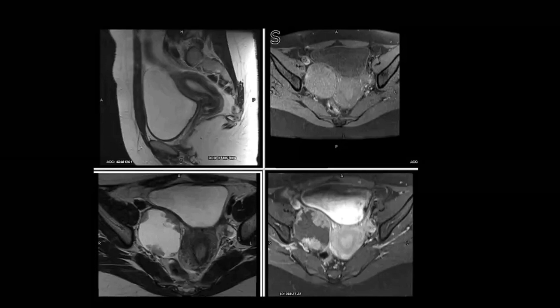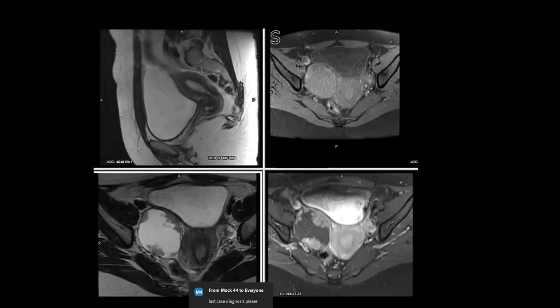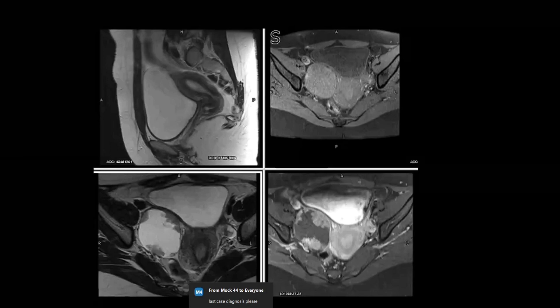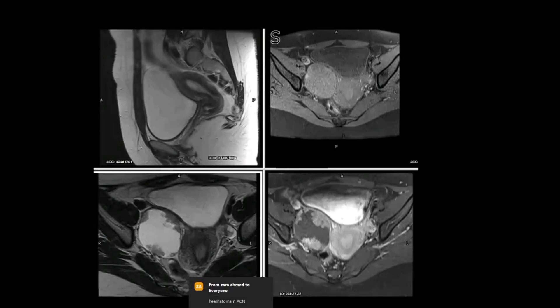If it is ultrasound, make sure you put on Doppler to see if there is any flow, because sometimes hemorrhage within a cyst may appear as internal nodules. If you put on Doppler, you will not find flow in hemorrhagic clots, but if it is a neoplastic lesion, you will definitely find Doppler flow in the solid component of the cyst.